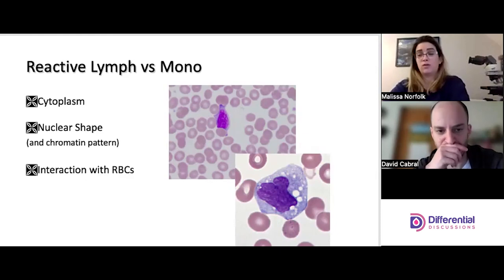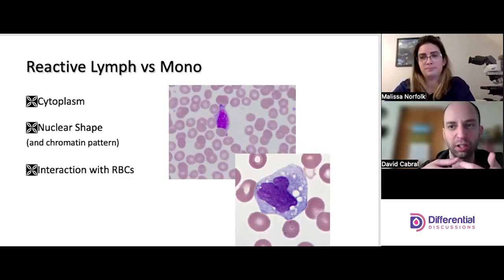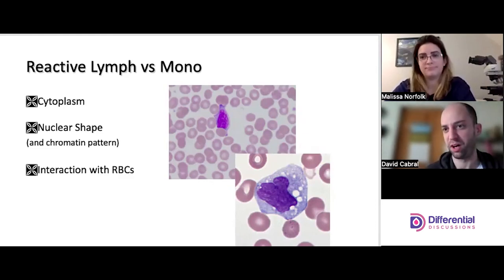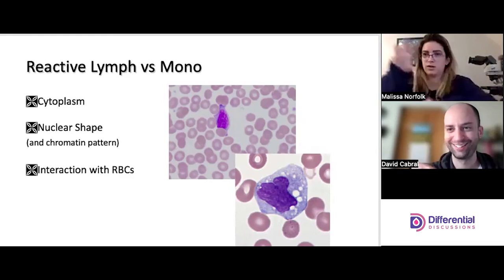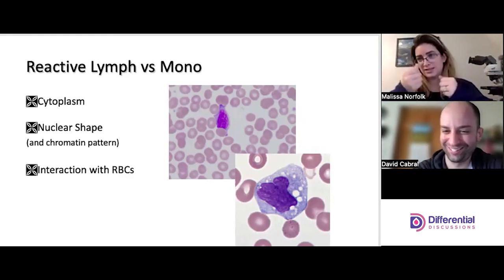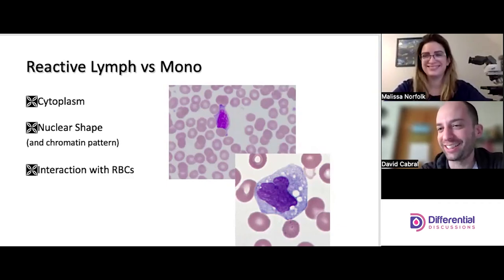Chromatin pattern: it's going to be clumped in the lymph — but you have to understand that stretching will lighten the color and density, though it still won't have the lacy character of a mono. Reactive lymphs have really prominent white striations — like scratch marks on a chalkboard. Monos have the lacy pattern. Then there's the interaction with red cells: reactive lymphs grab and pull, while monos tend to push. This is the one that fooled me, which I think is actually nice because this stuff isn't easy.